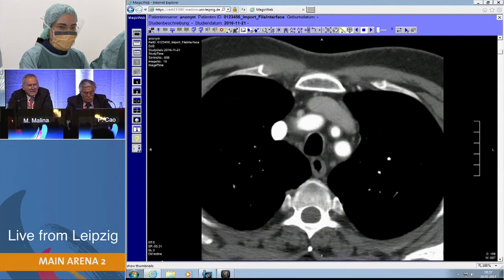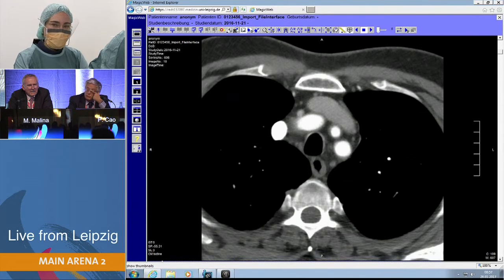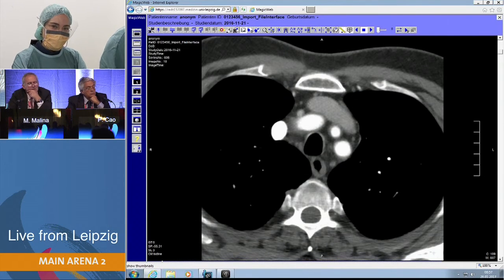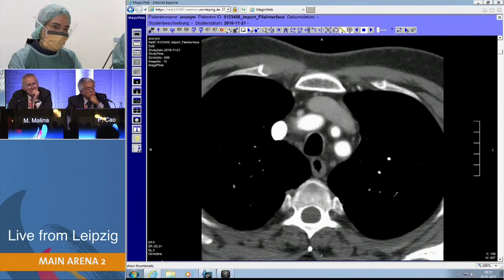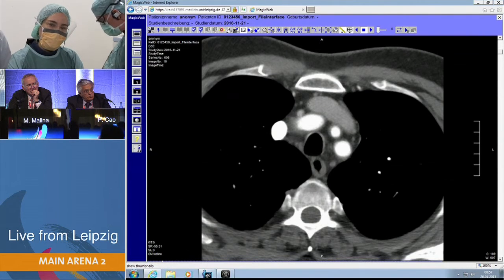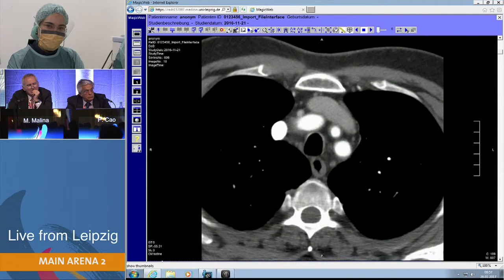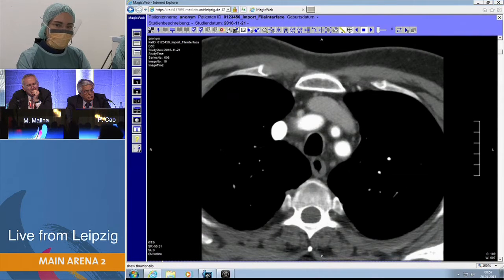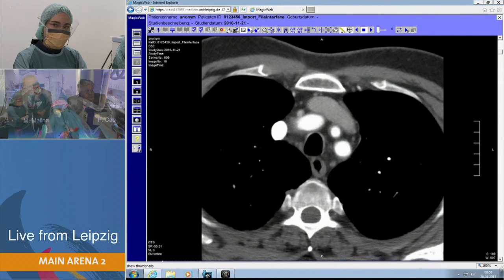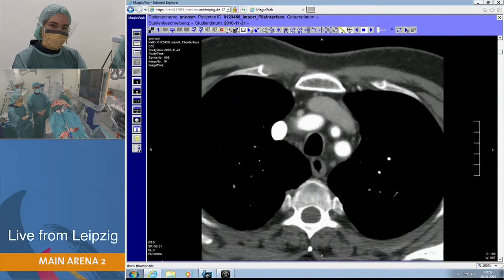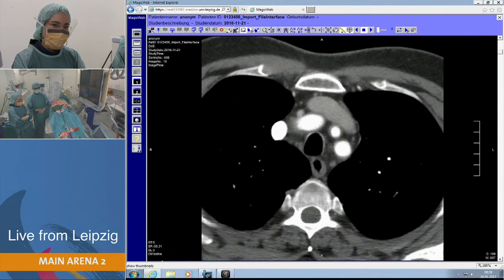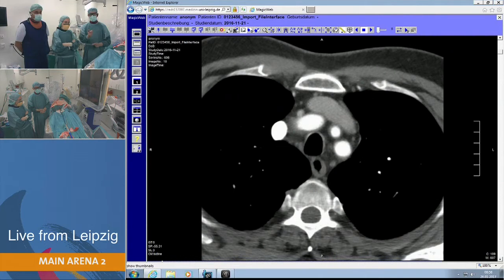As Andrei said, it's very important to look at the segmental arteries before planning your aortic procedure. Our goal is to completely coil the aorta that will be covered by the stent graft. It takes sometimes up to three sessions. In some patients, some segmental arteries are already occluded — we have encountered patients where all segmental arteries in the planned stent area were completely occluded. So it depends a lot on the patient's anatomy. Emergency cases cannot be treated this way.